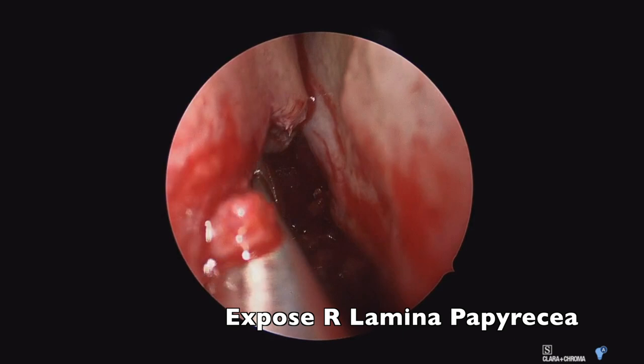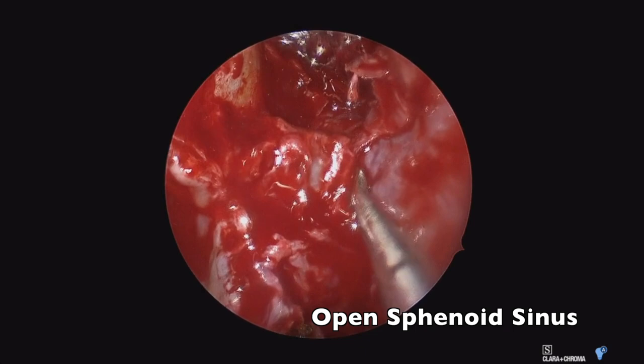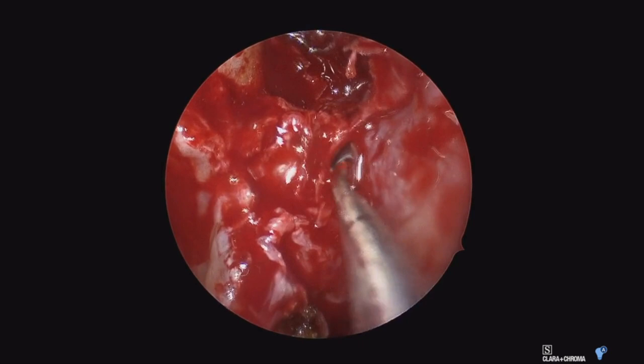Here we are on the right side completing an uncinectomy and opening the maxillary sinus for long-term surveillance, although the tumor is not directly involved in that area. We are also anticipating he will receive adjuvant radiotherapy, which can cause scarring and chronic sinus problems, so this is also helpful to prevent that long-term.